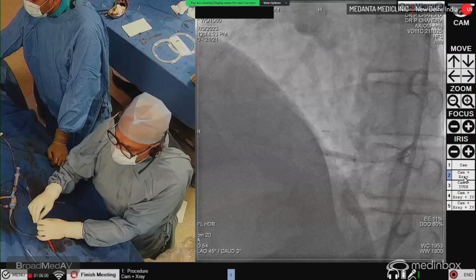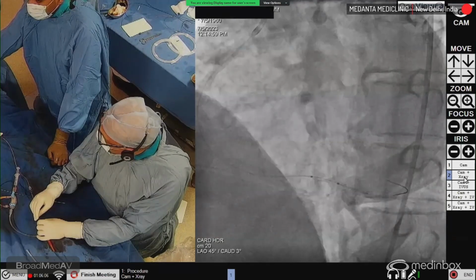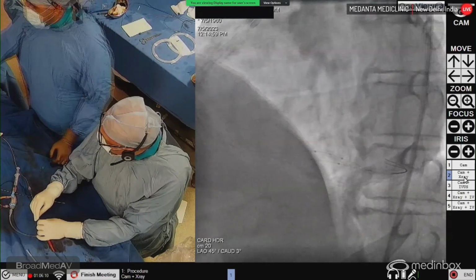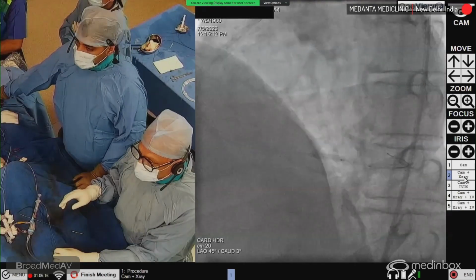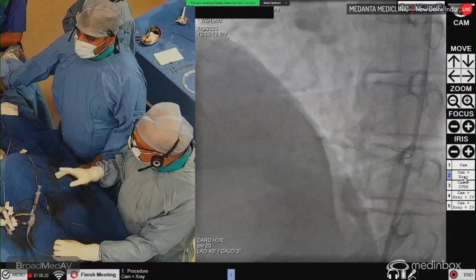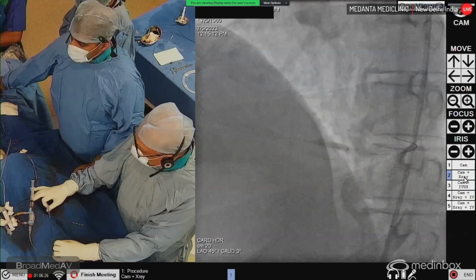And I'll go to higher pressures in the proximal segment of the stent. Okay. Yeah. So we are just at the stent edge. Go up, please. Go up 2, 4, 6, 8, 10, 12, 14, 16, 18, 20. Yeah. So we have gone to very high pressures and looks like that it is giving way. It has given way. Yeah.